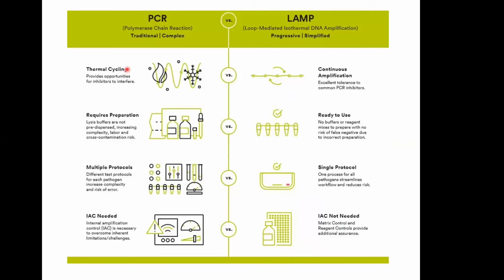So these are the advantages of using LAMP. As you can see, RT-PCR requires a thermocycler, whereas with LAMP you can continuously amplify, with fewer reagents, okay? And it can be a one pot reaction. It can be combined with, for example, the lateral flow technique just now. It can be combined with microarray, as well as any other methods to detect the existence of the virus.